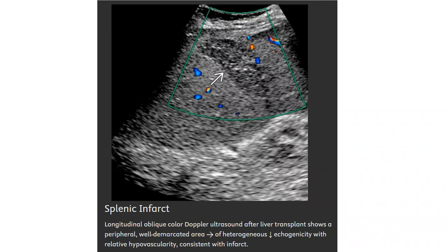Color Doppler ultrasound after liver transplant showing a peripheral avascular wedge-shaped area of decreased echogenicity with relative hypovascularity, consistent with splenic infarct.